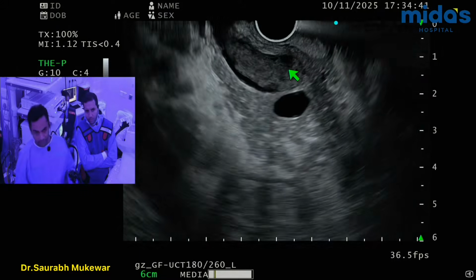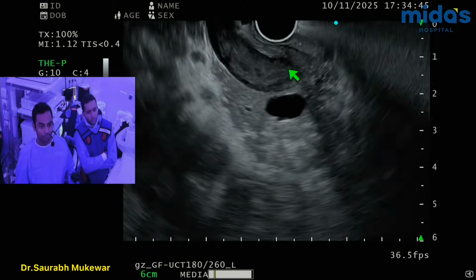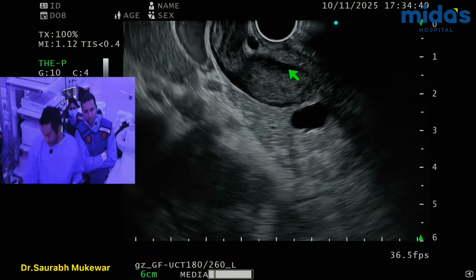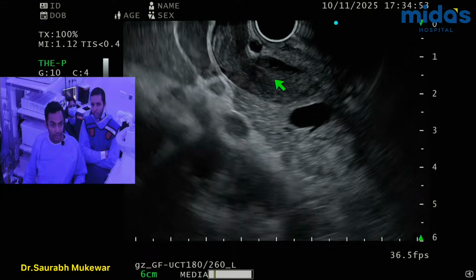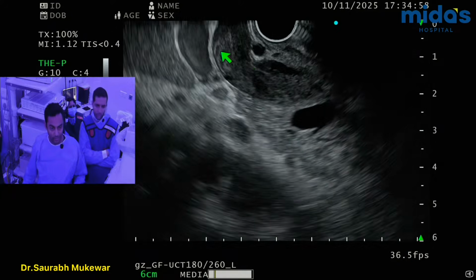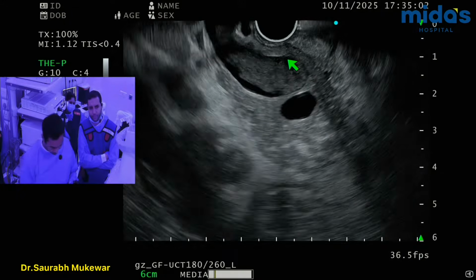Not the spot fluoro. This may be a little better, just because, if I can get the wire and my idea is going to be that stent goes from here and there's a straight up till here. That's it. So it's all straightforward. Right? So it makes sense to go from here. All right, ready? Needle?